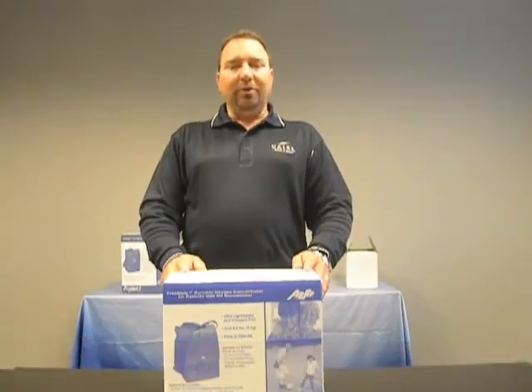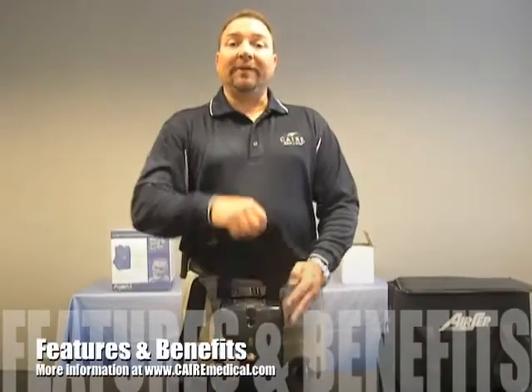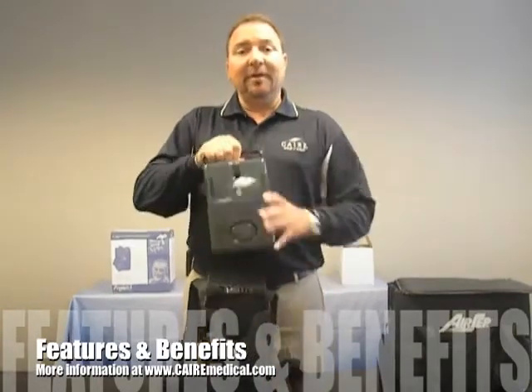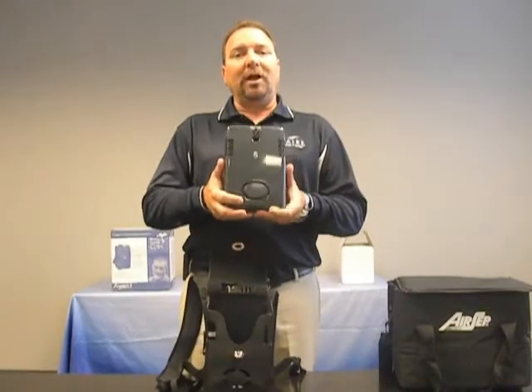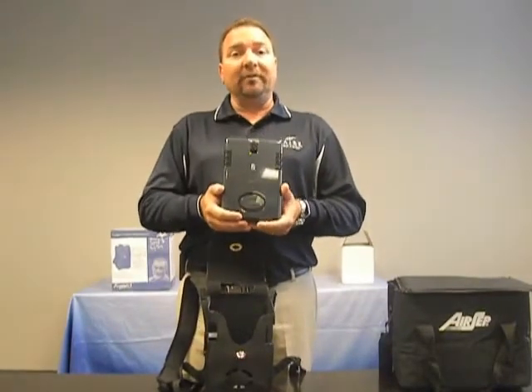Hello, my name is Don Seidel. I work for Care Medical, a division of Chart Industries. Let's talk about the features and benefits of the Freestyle Portable Oxygen Concentrator. The Freestyle is a very lightweight, wearable, portable oxygen concentrator that weighs 4.4 pounds.